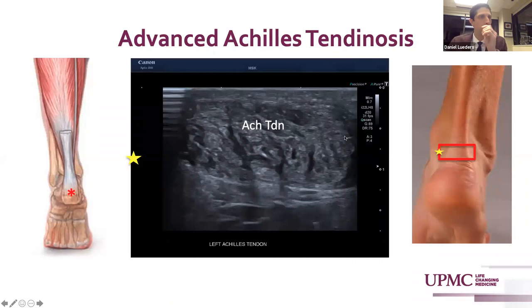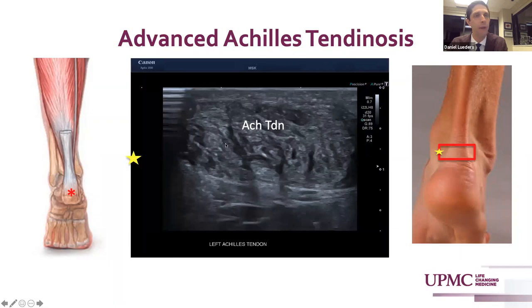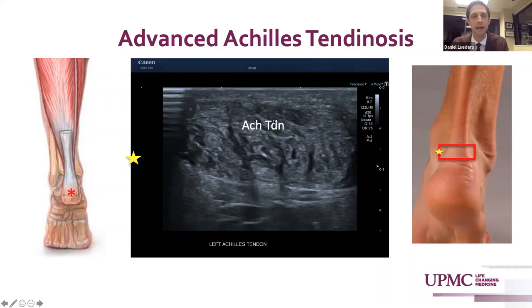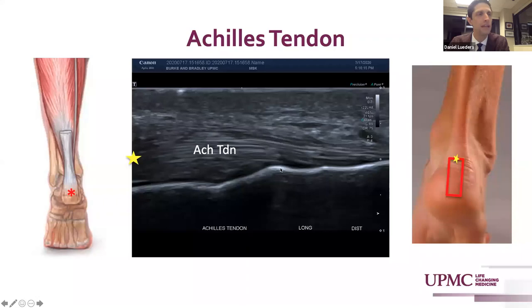This is a short axis view of the severely tendinopathic Achilles tendon — strikingly thickened, almost 12 to 15 millimeters thick, with large hypoechoic intratendinous clefting suggesting prominent tendinosis and an irregular bogginess, indicative of chronic severe tendinosis. In its insertion to calcaneus, the Achilles tendon has a broad insertion spanning about two to three centimeters. Its insertion should be evenly hyperechoic — when there are punctate hyperechoic calcifications that can suggest tendinosis or tearing.